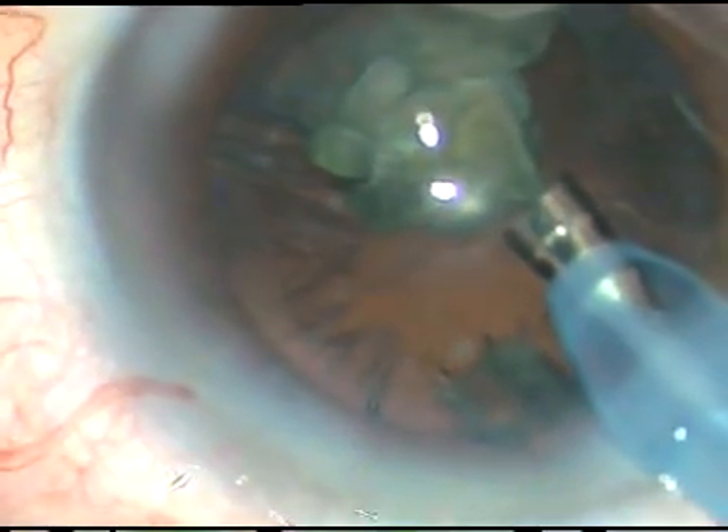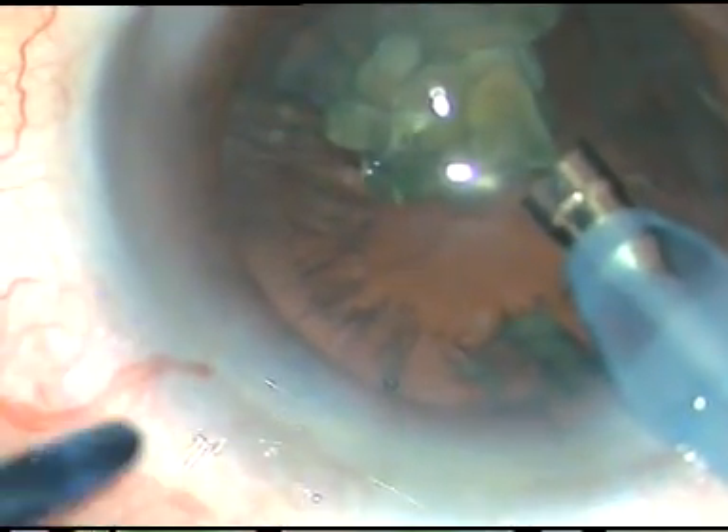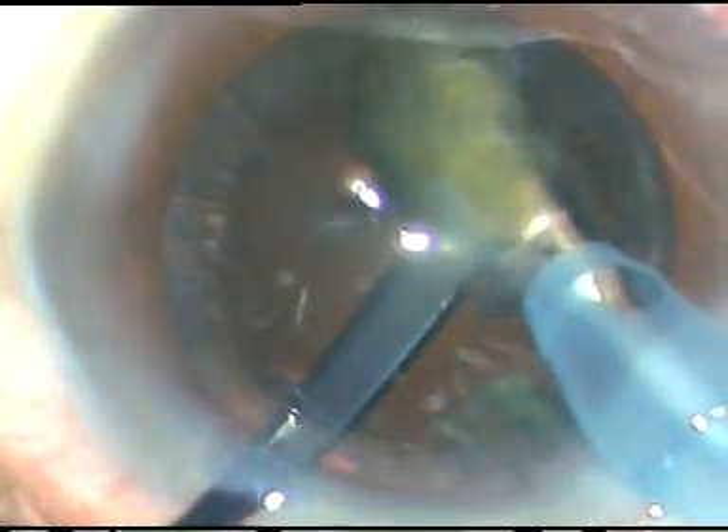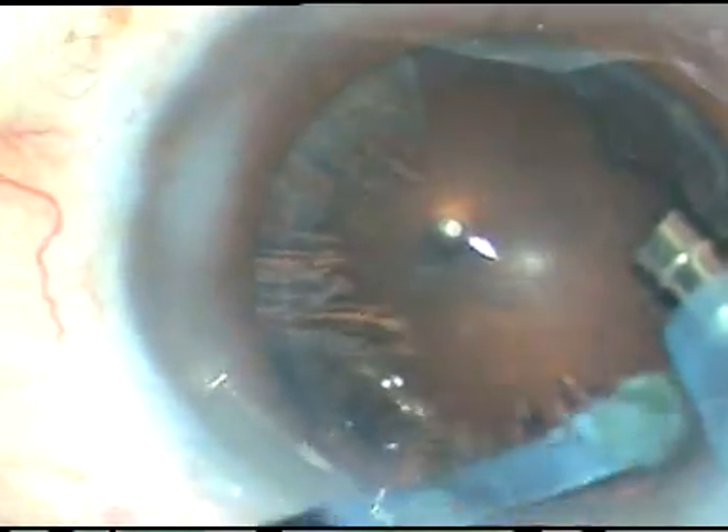The instrument is introduced through the side port. It can easily go through a one-millimeter side port. Place it over the posterior capsule and very safely you can emulsify the last nuclear fragment.